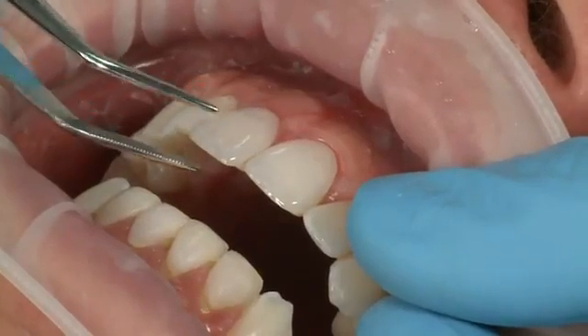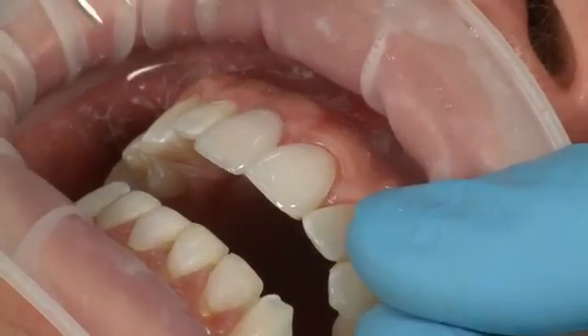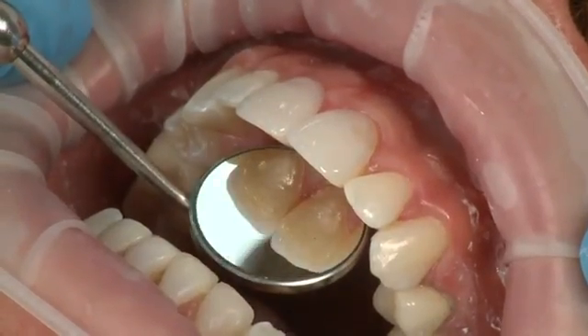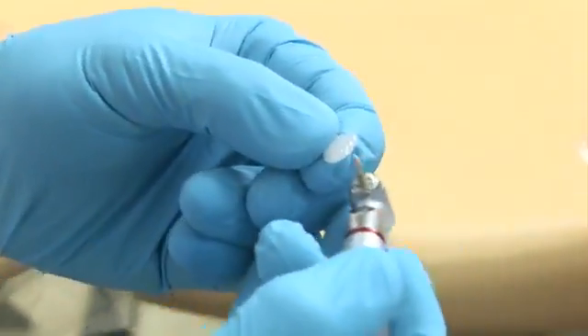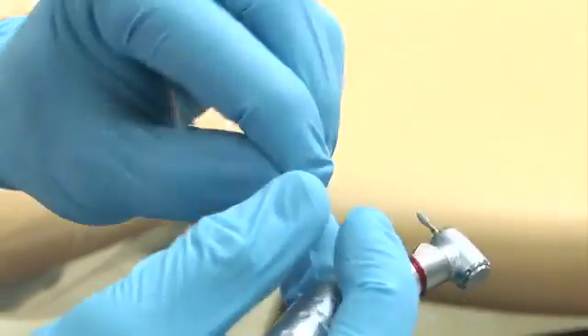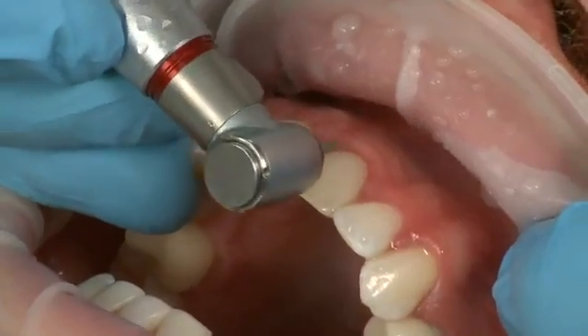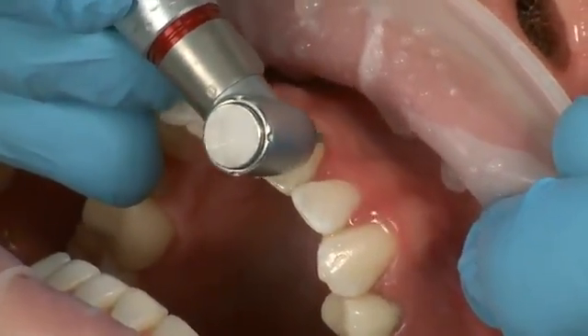Next, trial fit the Edelweiss composite veneer to ensure it is the proper shape and that it is adapted correctly. If it doesn't fit correctly, continue to shape and trial fit the Edelweiss composite veneer until it is adapted correctly. You may also need to readjust the prepared tooth to ensure a proper fit.